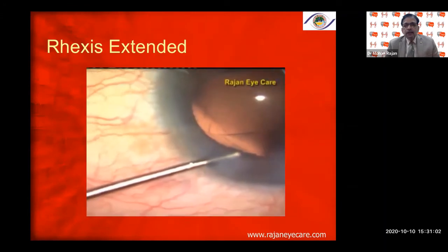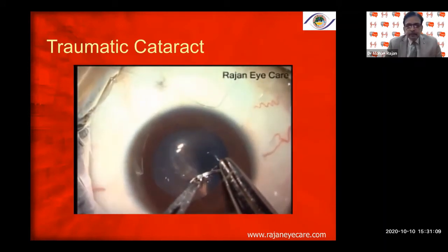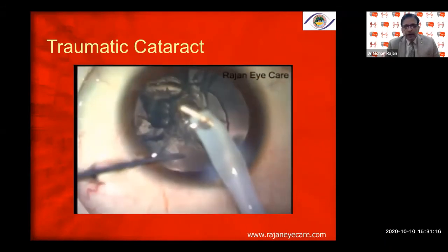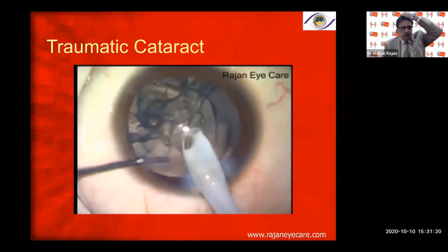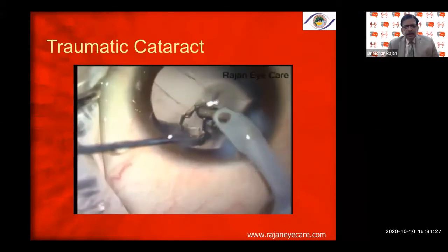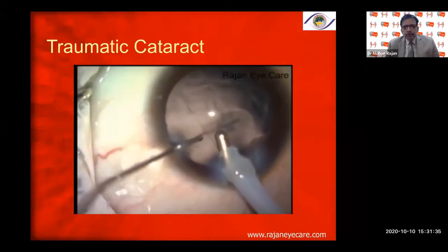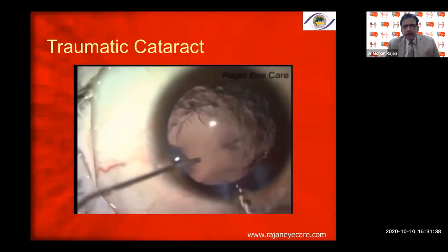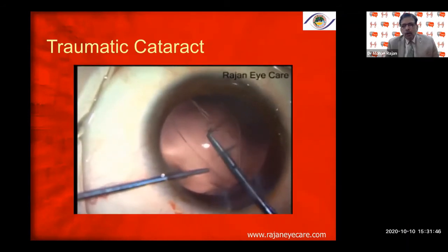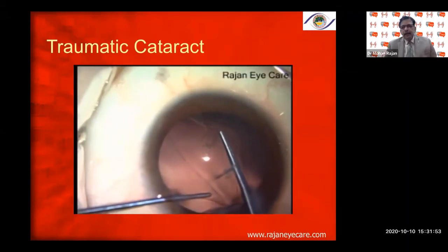Just to show a traumatic cataract with a pre-existing Argentina flag sign due to a stick injury in an 8-year-old — the cataract was very soft and required only irrigation-aspiration. You can see the two flaps on the anterior capsule, which is an Argentina flag sign from the stick injury. I went ahead, and whenever there is a rhexis tear, always inject viscoelastic and come out. I tried to convert one side into a semi-circular rhexis and the other side similarly, then put a single-piece lens into the bag.